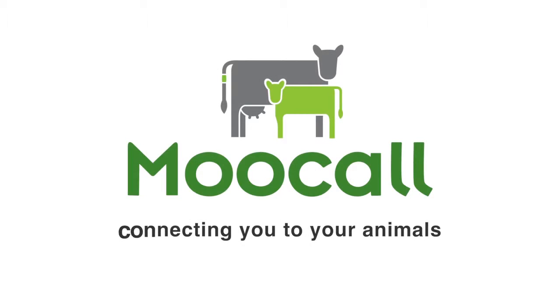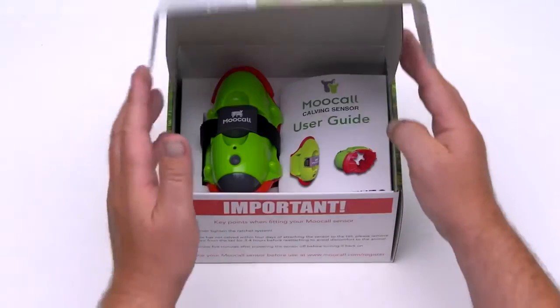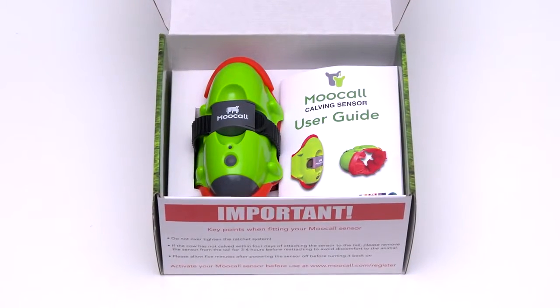The Moocall calving sensor, connecting you to your animals. Congratulations on choosing a Moocall calving sensor, the remote calving sensor that accurately predicts when a cow is about to give birth.